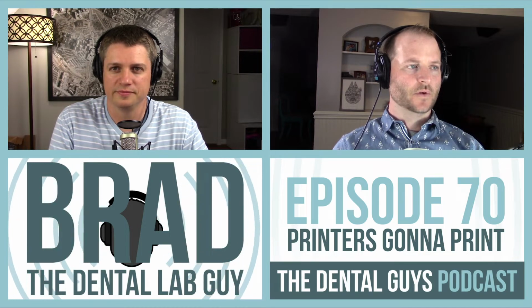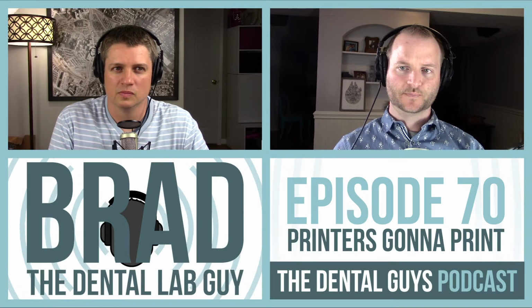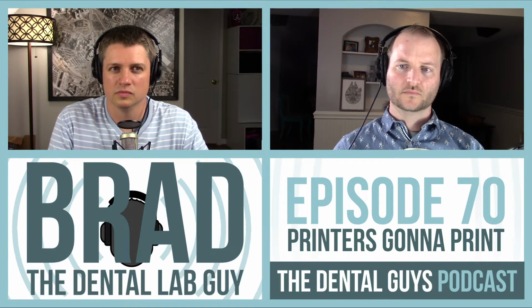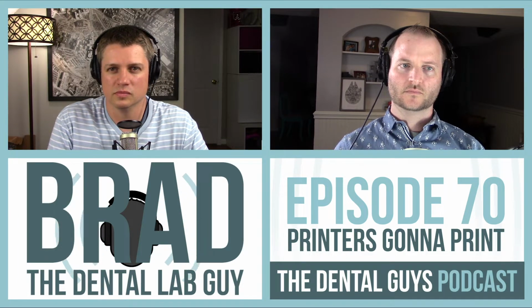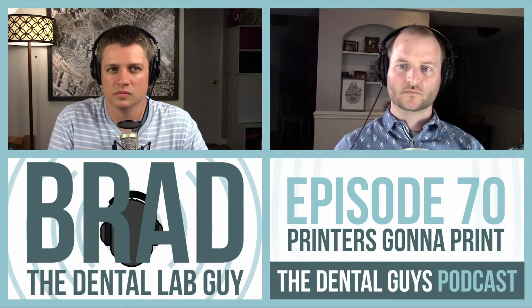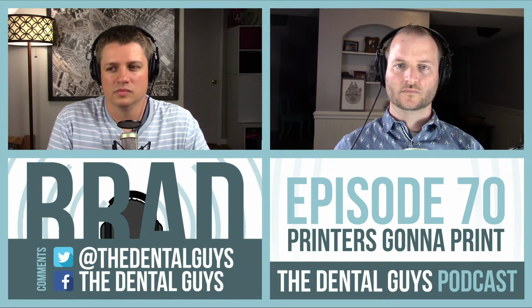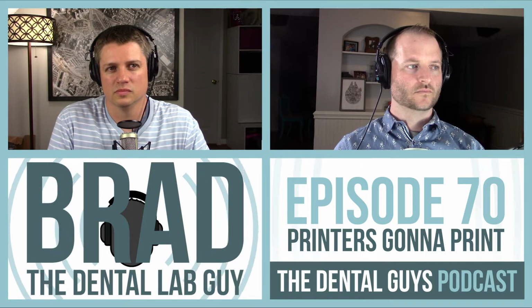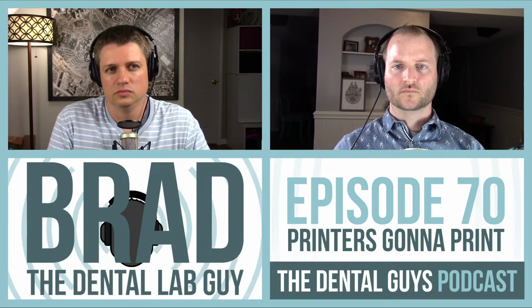So that's pretty high for laboratories. I'm talking laboratories, not dentists. Because there's so many applications to print. There's so many materials that you can print right now, whether you're doing burnout type materials for crown and bridge, or RPDs, or splint materials, or denture base is a new thing coming, or model resins. There's even just R&D stuff. We have a printer just for R&D.